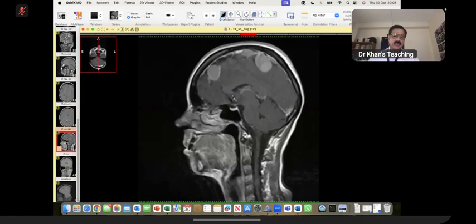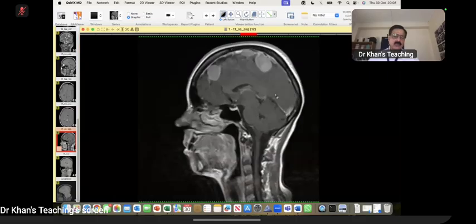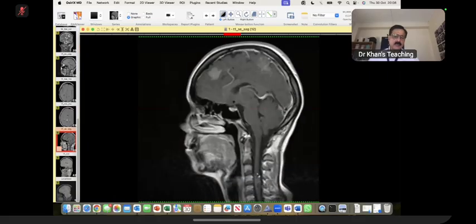So, conclusion: I could have shown you this, but the way the viva went, I did not show you. And here the key thing was that there was also an ependymoma in the cord. So you went into the neural axis bit. The way you tackled it, you took too much time. So once again, my feedback to you is try to close the case. Try to close the case, and the time is yours. Okay, thank you very much.